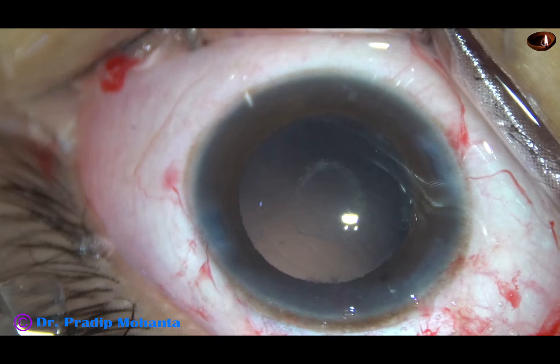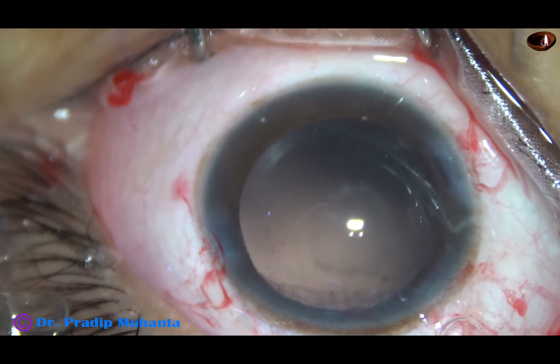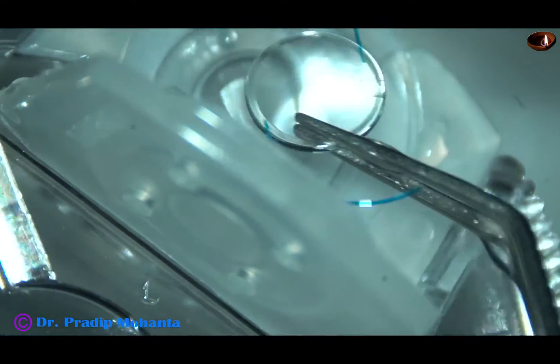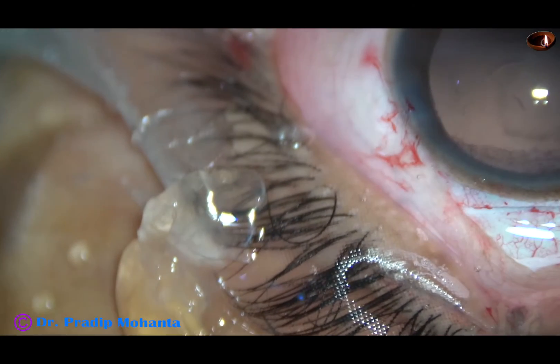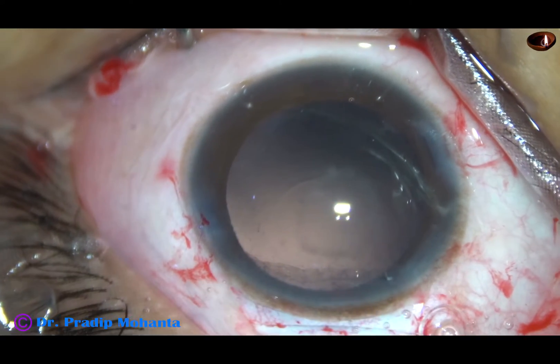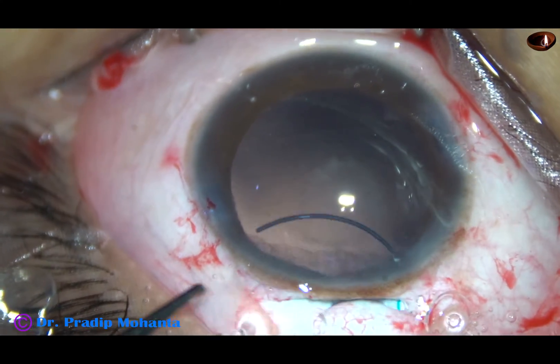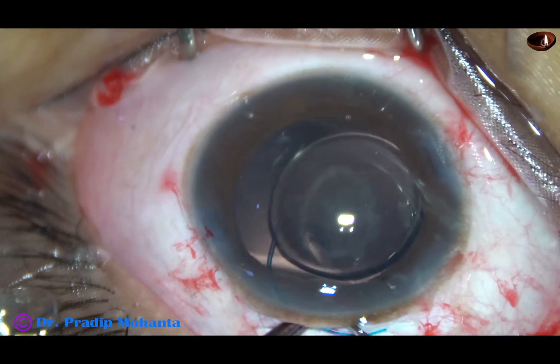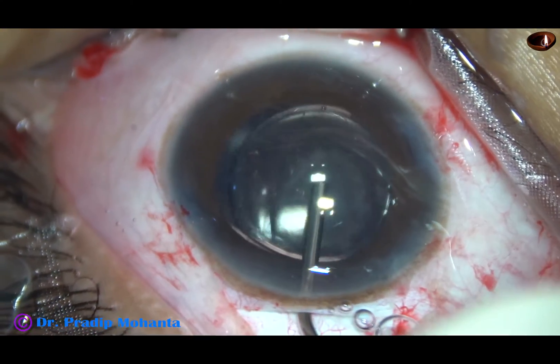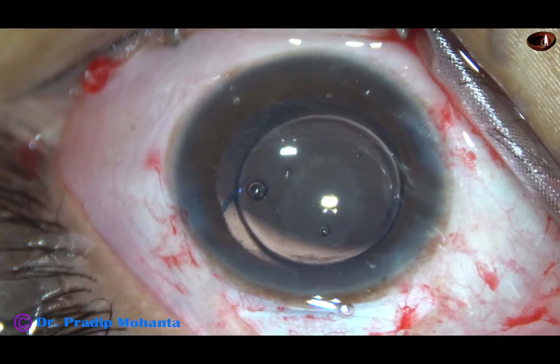And now the anterior chamber and capsular bag is filled up with 2% hydroxypropyl methyl cellulose. In this case, I have selected a sensor multipiece intraocular lens. I am not going to use any cartridge — the lens goes in straight without folding because I have a 6 mm wound. The lens goes in; the leading haptic goes into the capsular bag, and the trailing haptic is placed in the capsular bag with the help of McPherson's forceps. The lens is nicely placed in the capsular bag.